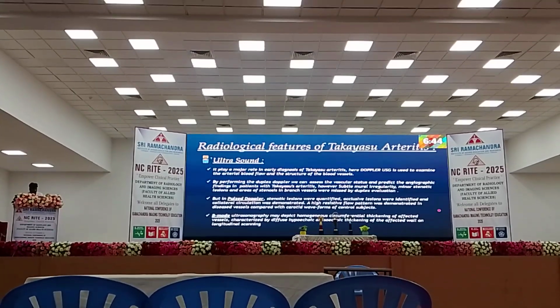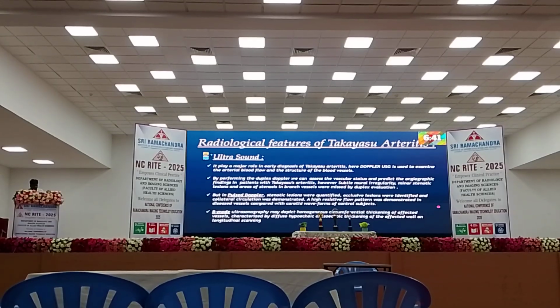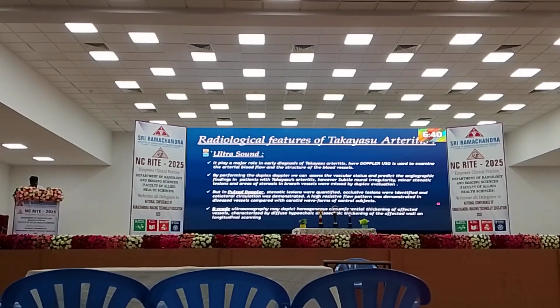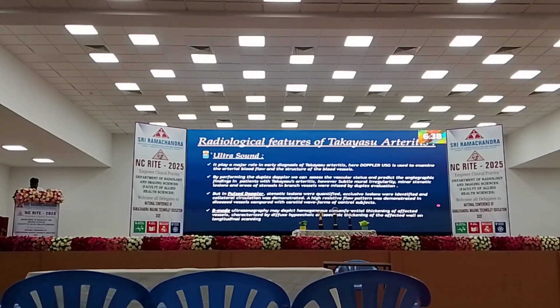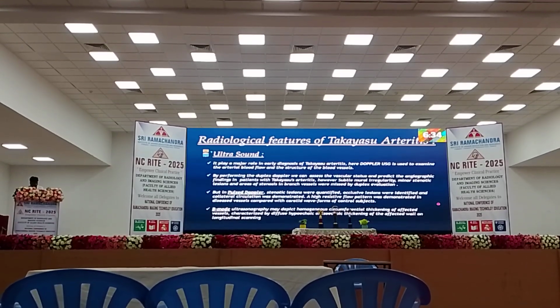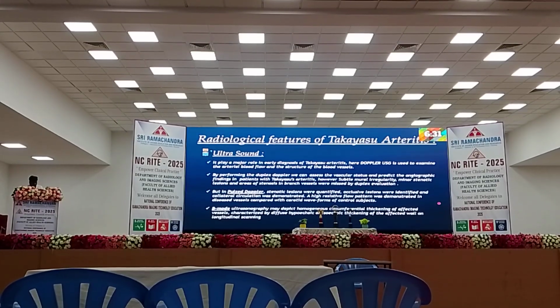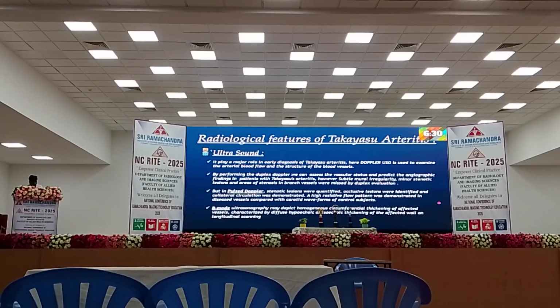Radiological modalities for Takayasu Arteritis. Ultrasound. It plays a major role in early diagnosis of Takayasu Arteritis. Doppler is used to examine the arterial blood flow and the structure of the blood vessels. By performing the Doppler survey, we can assess the vascular status and predict the angiographic findings in patients with Takayasu Arteritis. With pulse Doppler, stenotic lesions are quantified, occlusive lesions are identified, and collateral circulation is demonstrated.